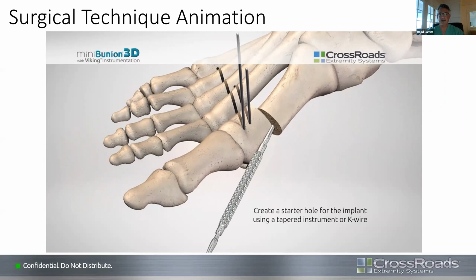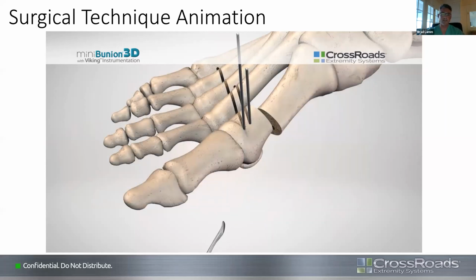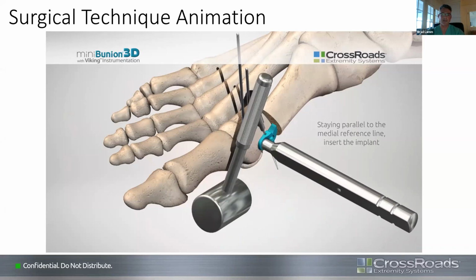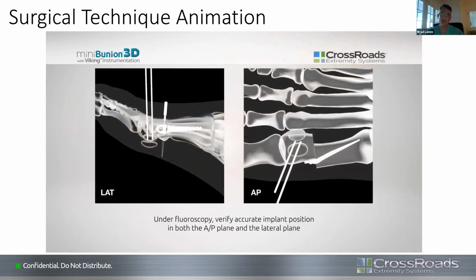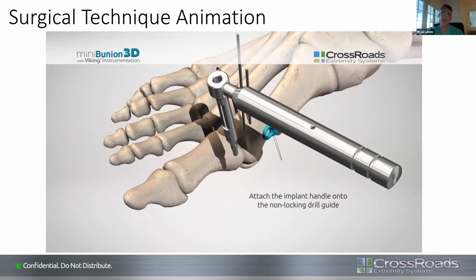You make a pilot hole in the first metatarsal that gives you the translation that you're looking for. And then you insert the implant as shown here, where you really want to make it parallel, and you tap it in. On the lateral, you want to be up the shaft, and on AP, you want the implant to be pretty vertical on an AP X-ray. So you make sure you've got it inserted.